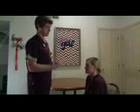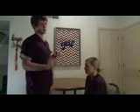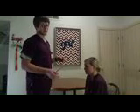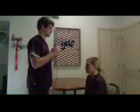So first I'm going to listen to her heart at the 4 different spots. We're going to do first the aortic, then the pulmonic, then the tricuspid, and then the mitral, which is where I'll listen to her apical pulse for a full minute. I'm just going to do 30 seconds for the video's sake, but in the hospital setting, we should go ahead and listen to it for a full minute. So I'm going to start here. I'm going to start with the bell.